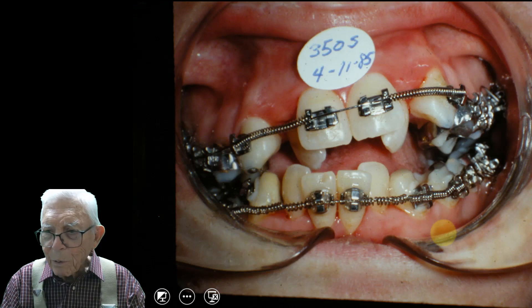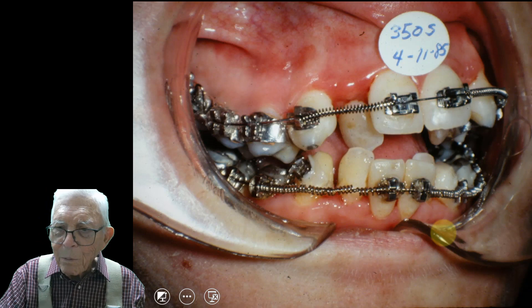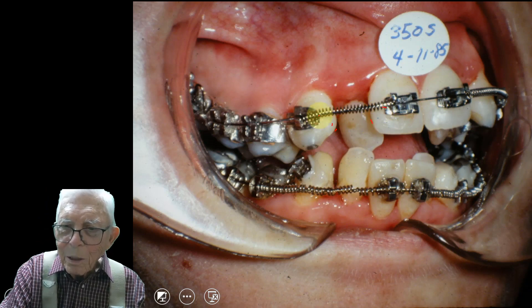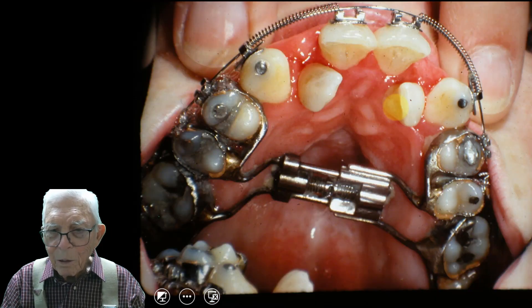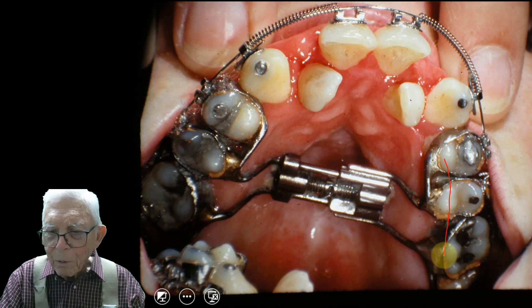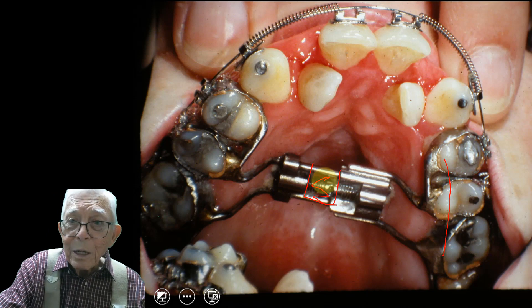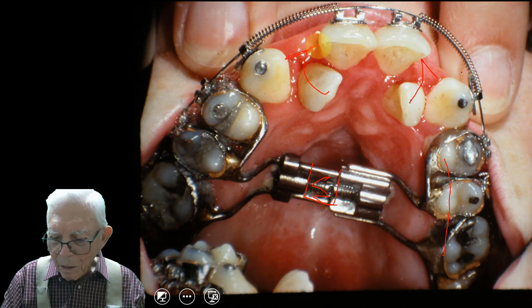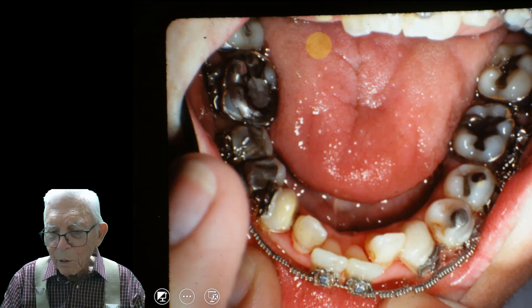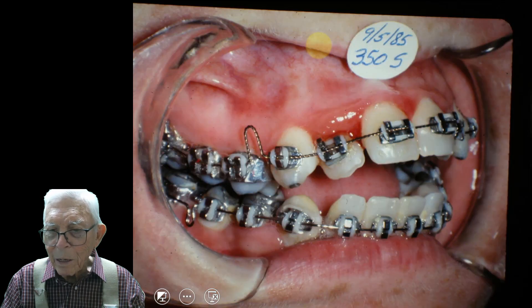This is the spring we put in as we start widening out. The bite opens again. And you remember when these two teeth were together — we got it almost open there where the lateral comes in. The other side is open too. Here is another palatal separator we put in. We're going to widen it — it's been widened out that much right there. So we're going to increase it out here and bring this lateral and stick it in there. This one will have to come in here and line up. You just work and work and it gets looking better as you go along, which encourages you a little bit. The bite opens, but then it closes back down again as you do the work.